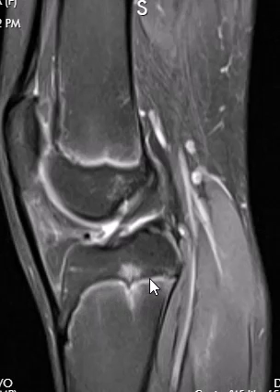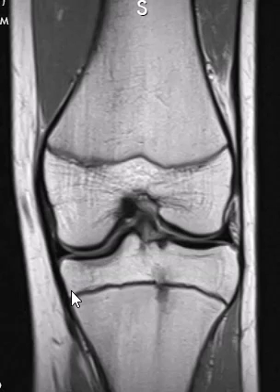We can see it here in the tibia — the localized marrow edema — and then here on this coronal view as well. There's a PD sequence.